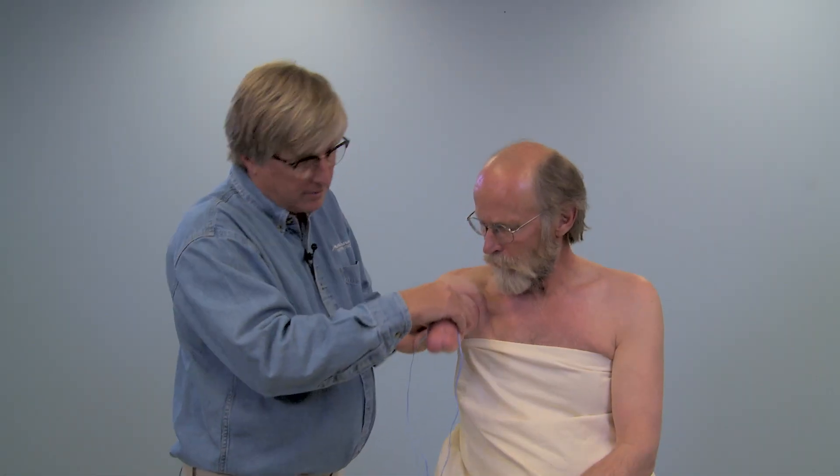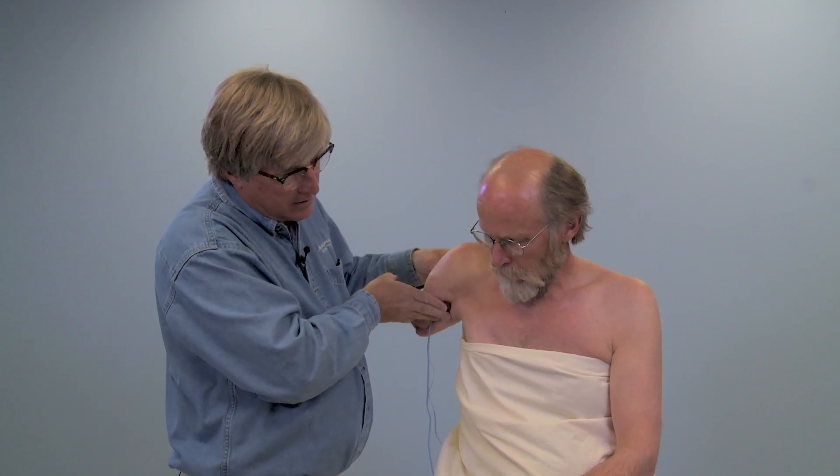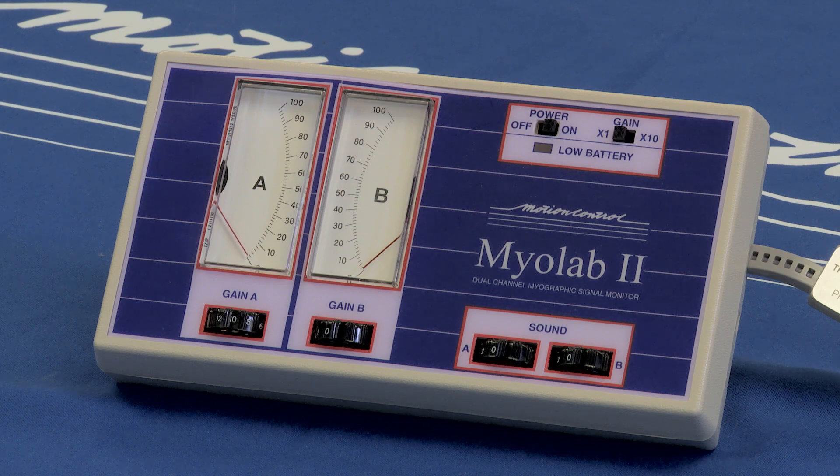While holding the electrodes in place, have the patient move the shoulder through the range of motion and watch for inadvertent EMG signals.